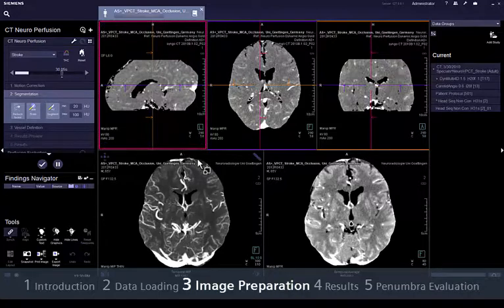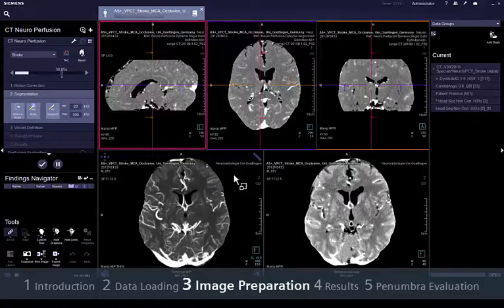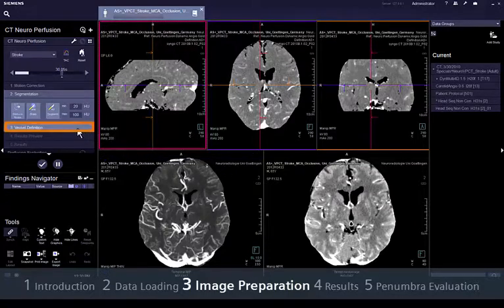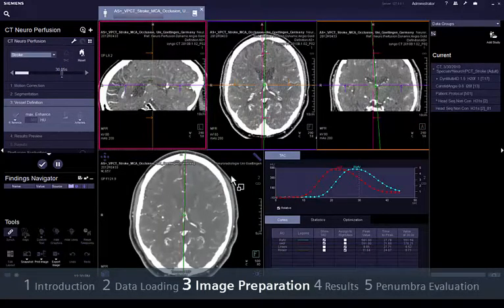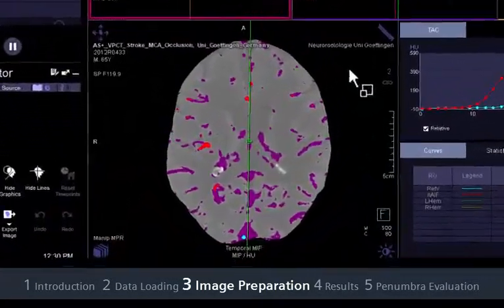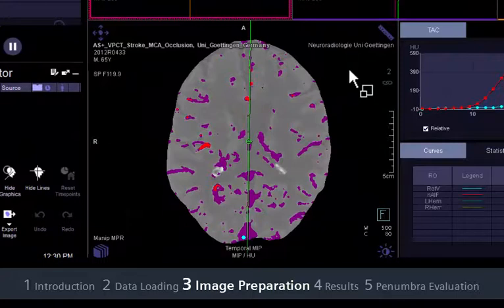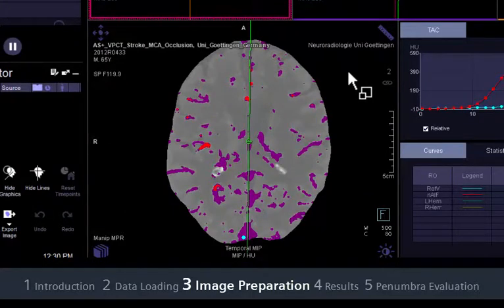In this step, an automatic segmentation of the parenchyma is done. When switching from step 2, segmentation, to step 3, vessel definition, all major vessels are detected and displayed in magenta. The reference vessel, typically the sinus sagittalis, is detected with a blue area.